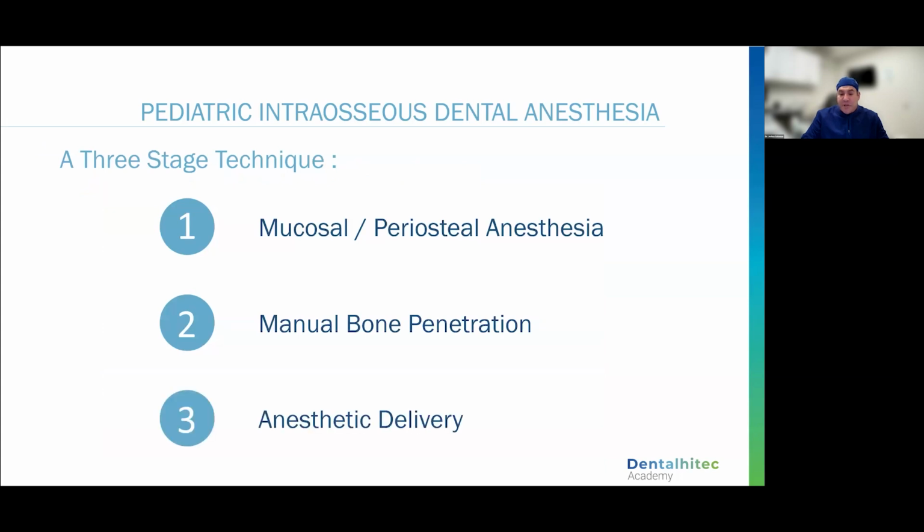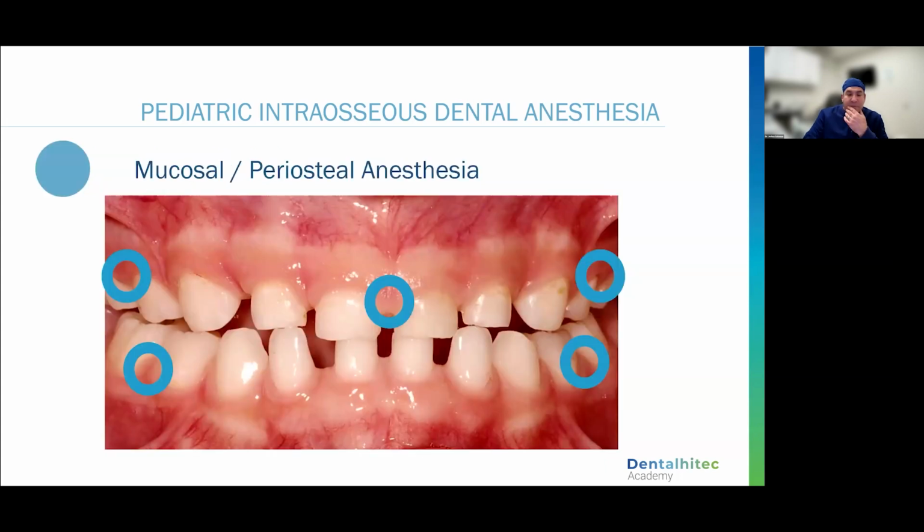Then our bone penetration. What I want to remind everyone is you're not necessarily going to feel the pop every single time. I find that with patients 6 or 7 and above, you have a much higher chance of feeling the pop, but for that 2, 3, 4, 5-year-old, sometimes 6-year-old, it doesn't mean you've done things wrong. It just means that their cortical plate is thin enough that you're passing through without feeling a pop.